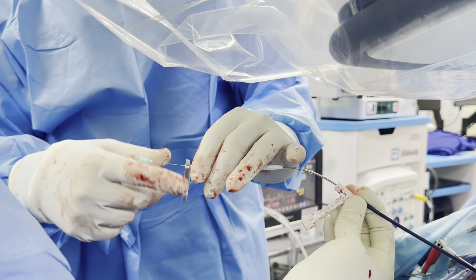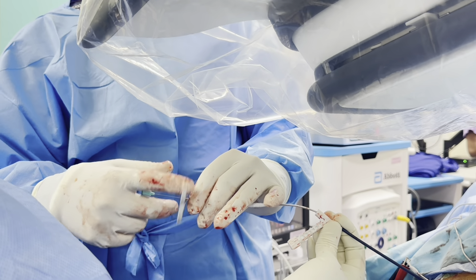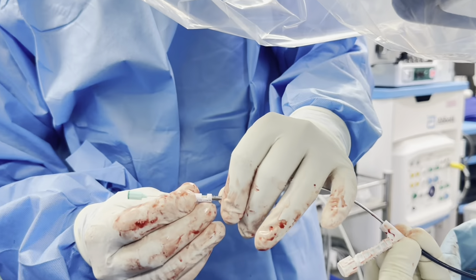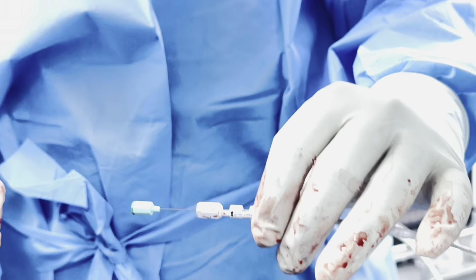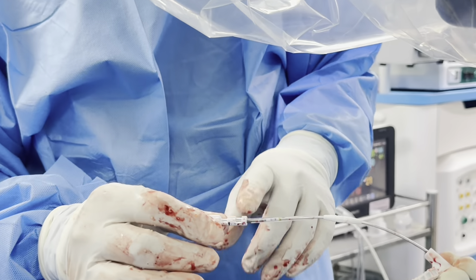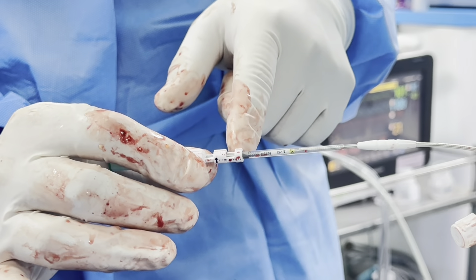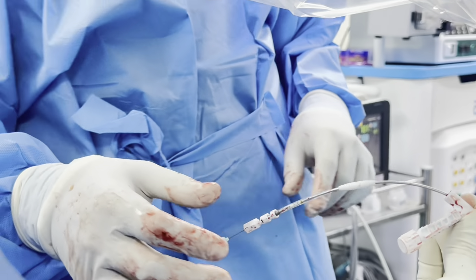The lead is inside the catheter only. So 12 turns. Once we have extended the helix, we will just put it there. The helix which has been extended should not come back when you are making rotations. So it will lock the helix in the extended stage. You can also check while screwing in. It is the free part here, it is not totally covering. And there you can check the signal.